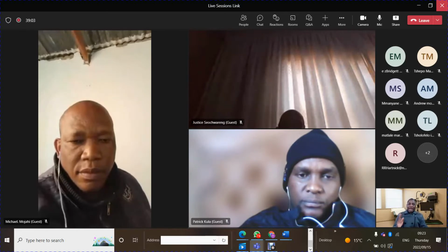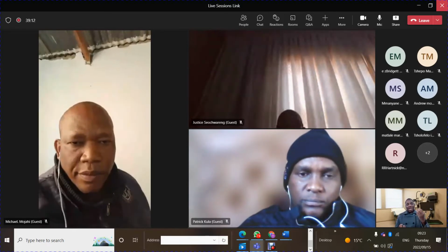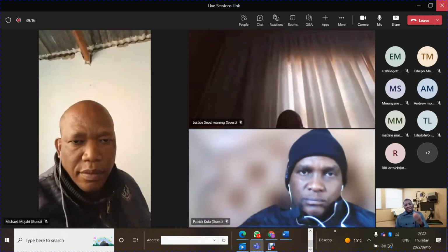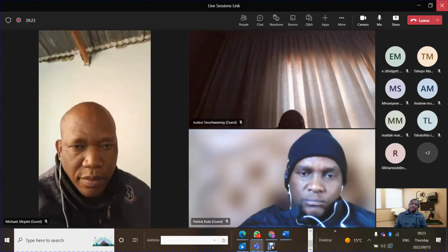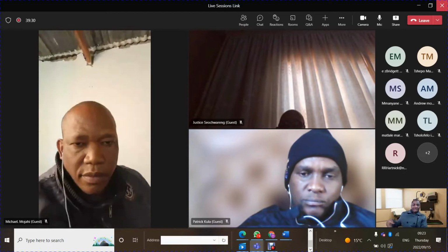So that combined with the color of the blood, which is what determines how much light will go through and how much is picked up on the other side. The more reddish it is, the more oxygen you have. And the poorer the amount of oxygen in the blood, the less of the reddish color you have, and it will be picked up on the other side. And when that signal is amplified and goes through the algorithm built into it, it translates that into a number or a reading that you can see on the output side.